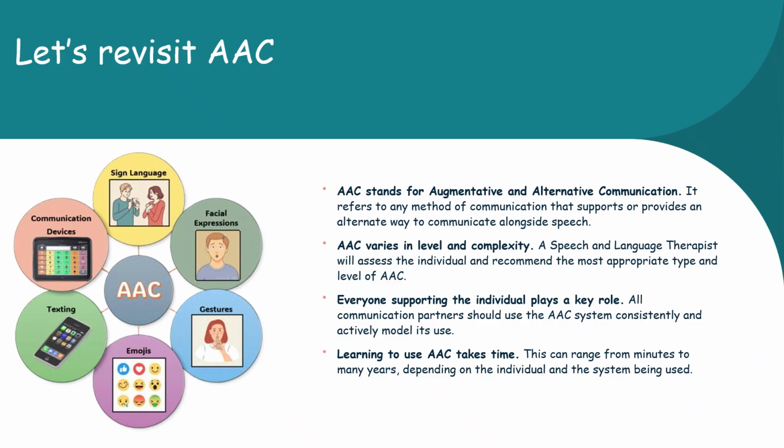communication support area. AAC can look very different from person to person, and it really varies in how complex AAC is and how complex it is for that individual. A speech and language therapist will assess and recommend the most appropriate system or level for each individual. It's really important to remember that communication is a shared responsibility. So everyone who supports the individual, whether we're at home, in respite, or in school, should be using the AAC system and modelling how to use it as part of everyday interactions all the time.